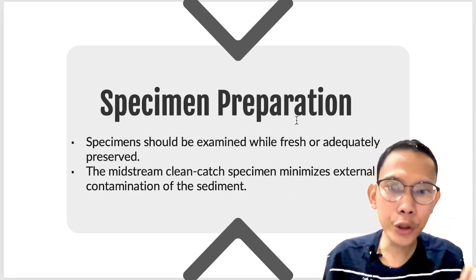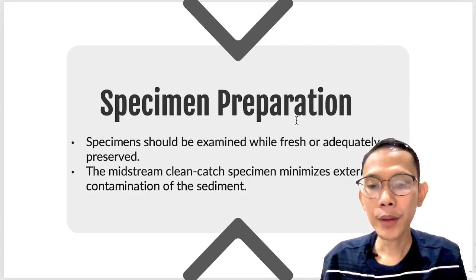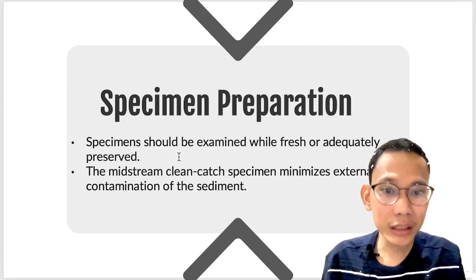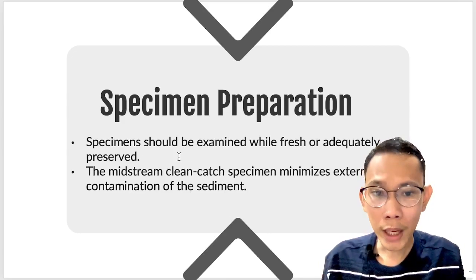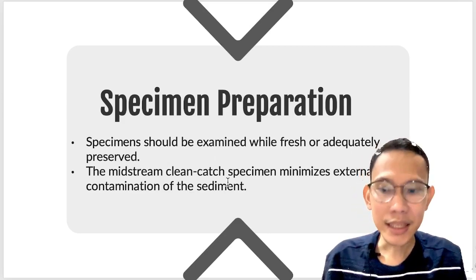So when you receive your urine, as soon as possible, you have to read the result. And again, before collecting that, you emphasize na midstream clean catch, di ba dapat yung ating specimen? Why? Because it minimizes the external contamination of the sediment.